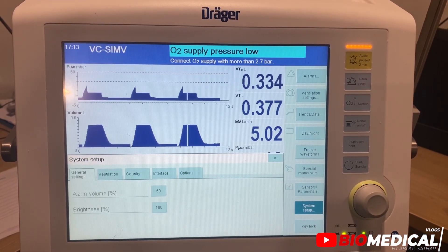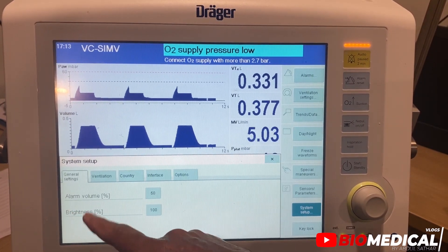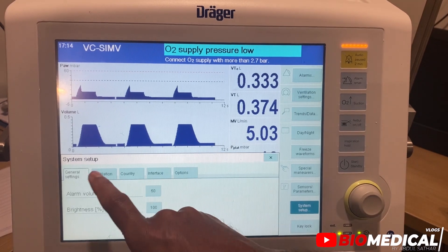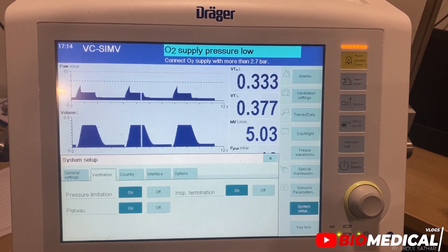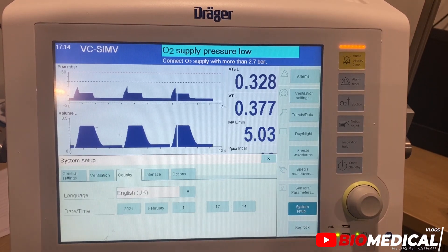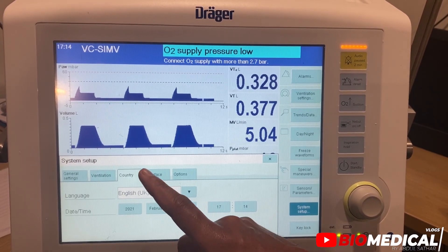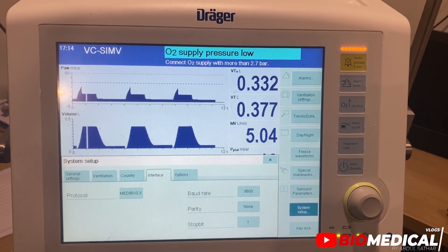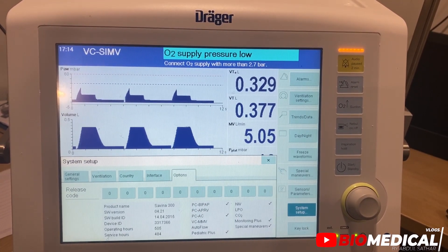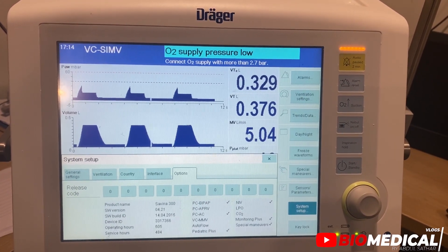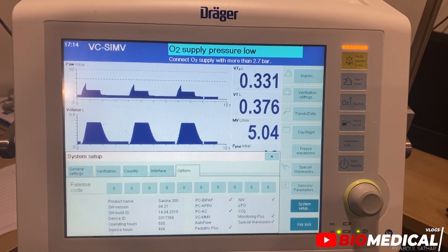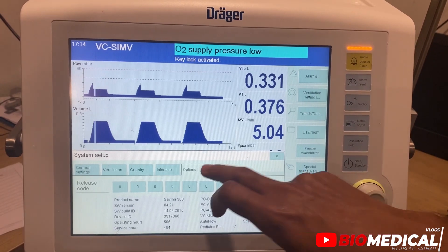Then we have system setup where we can adjust alarm volume and brightness. Then we have a key lock option — it locks all keys and buttons.